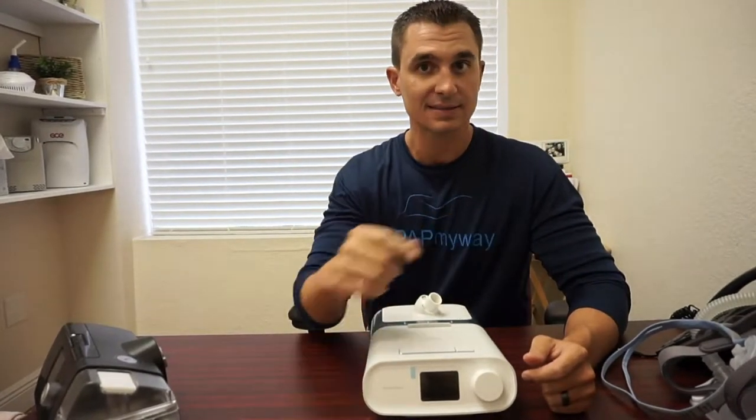As a general rule of thumb, you should be cleaning your supplies at least once a week. That includes the humidifier, the tubing, the mask, and especially whatever cushion, pillow, or seal you have on the masks, since that's touching your nose or face every night.